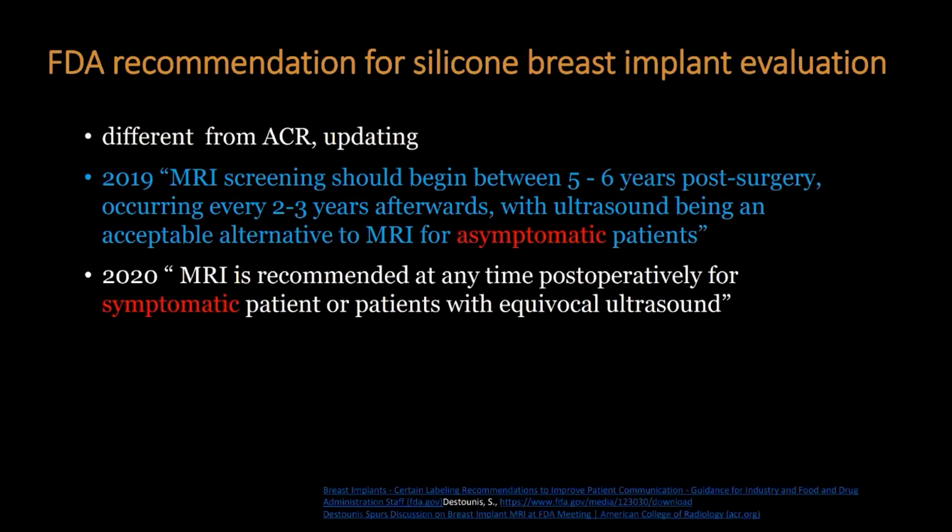And then in 2020, last year, they also added a recommendation for patients with symptoms. They recommend MRI at any time post-operatively for a symptomatic patient or a patient with equivocal ultrasound.